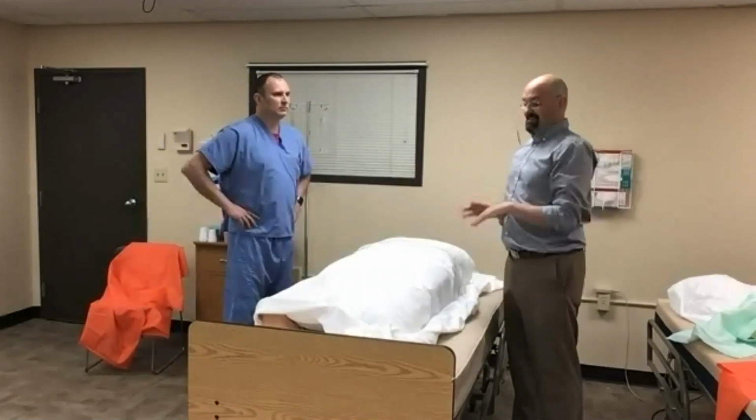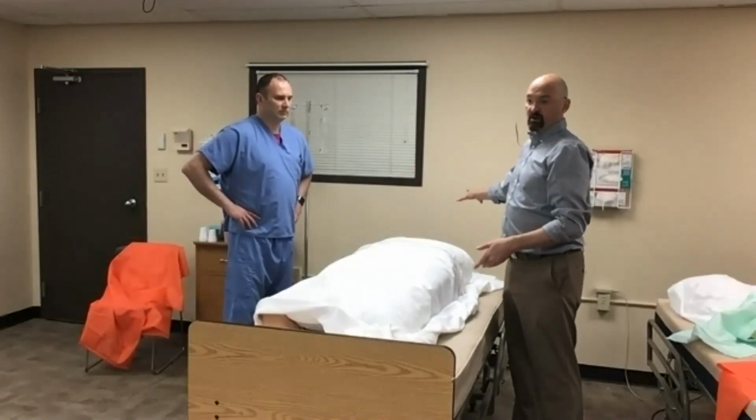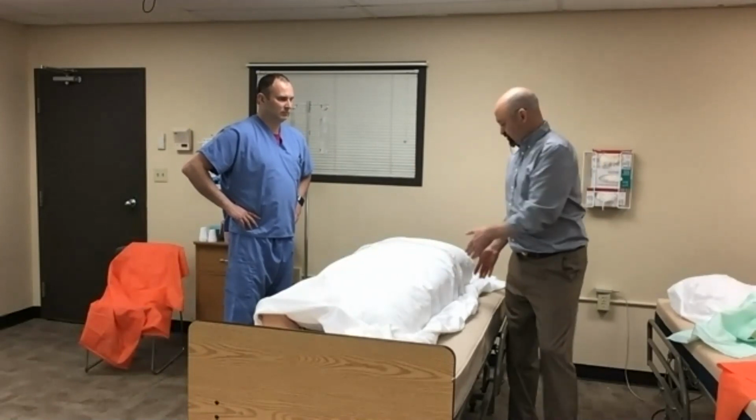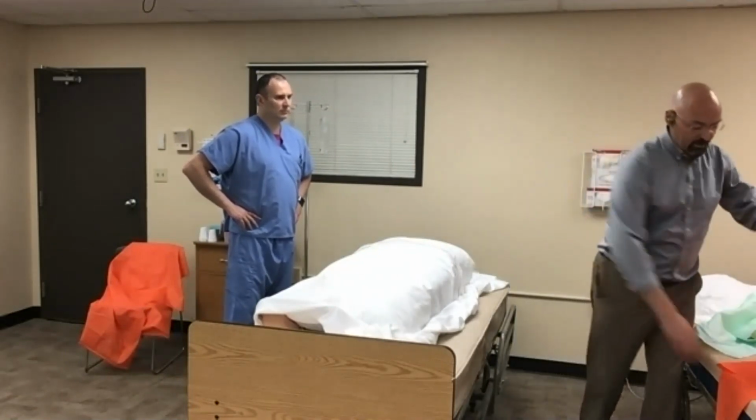When you're doing this, at minimum, you're going to have 3 people on either side plus 1 controlling the airway. Minimum 3 people on each side. So you're going to have 1 controlling the feet, 1 controlling the hips, 1 controlling the shoulder, 1 controlling the head. So there's 2 separate ways we can apply slide sheets.